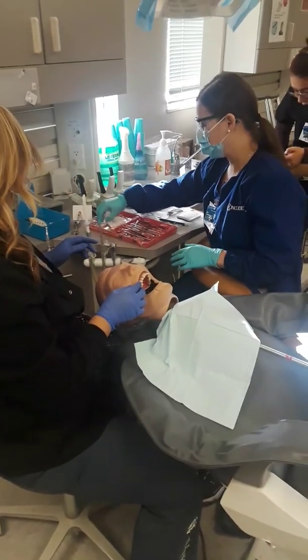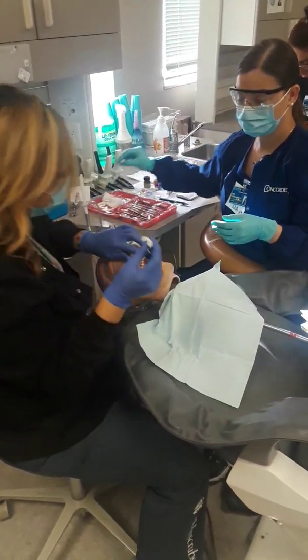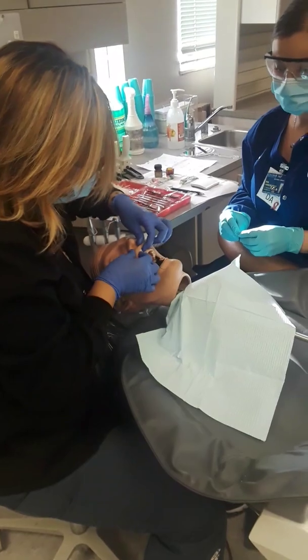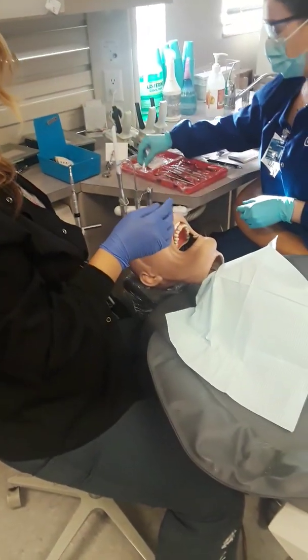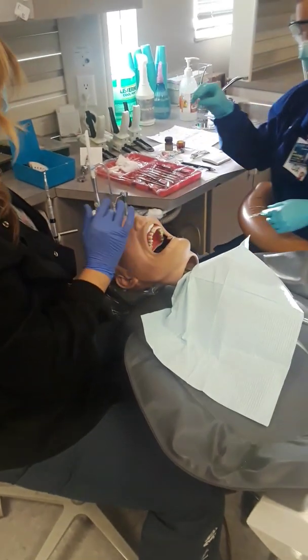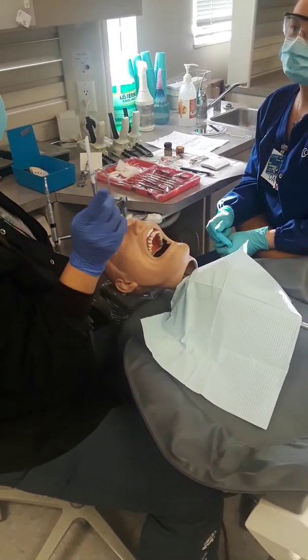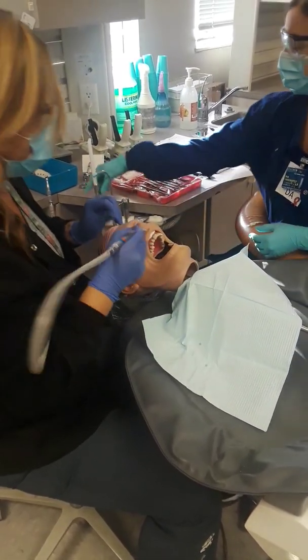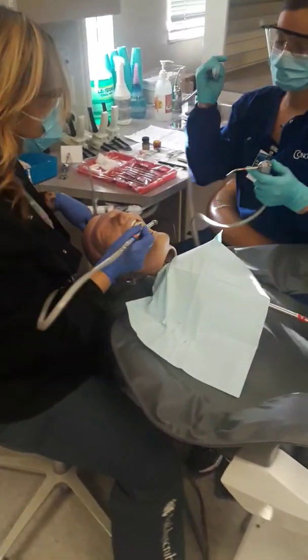And now we need to isolate. This not only keeps the lip out of the way, it's going to isolate the area so I don't accidentally cut that lip when I'm working. Just one. Yeah. Okay. One for the maxillary buccal, and then we do 2 for the lingual, 1 for the buccal on the mandibular. All right, first thing I'm going to do is gain access with my high-speed 557 bur. That's your Fisher.